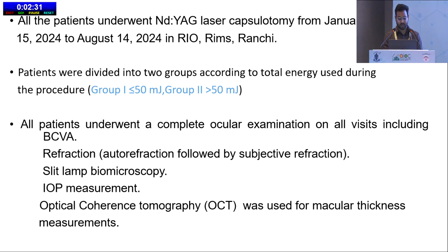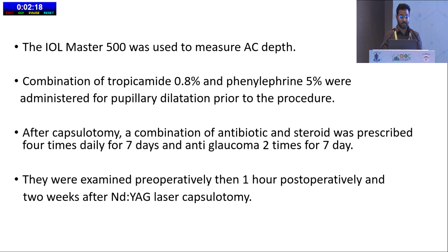All the patients underwent a complete ocular examination on all visits, including BCVA, refraction, slit lamp biomicroscopy, IOP measurement, and OCT for the macular thickness. The IOL Master 500 was used to measure the AC depth. A combination of tropicamide 0.8% and phenylephrine 5% was administered for pupil dilatation prior to the procedure. After the capsulotomy, a combination of antibiotic and steroid was prescribed 4 times daily for 7 days, and anti-glaucoma drug 2 times for 7 days.